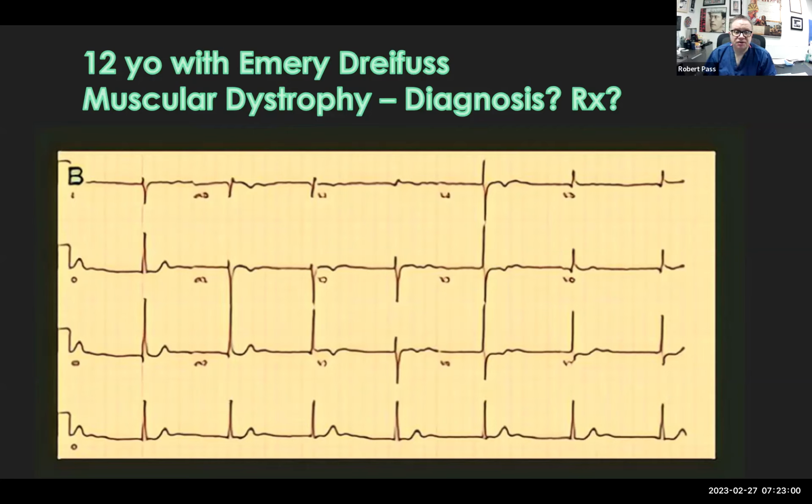There are some beautiful pictures where they did electroanatomical mapping and identified in patients with atrial standstill basically no atrial activity, scarification of essentially the entire atrium, or sometimes a single little pocket of area which has active atrial myocardium, but basically the entire rest of it is fibrosed or has no activity.